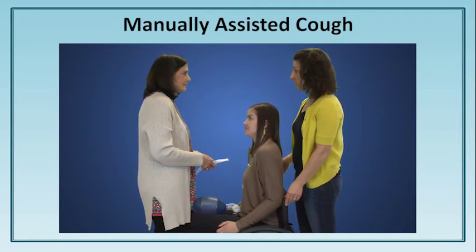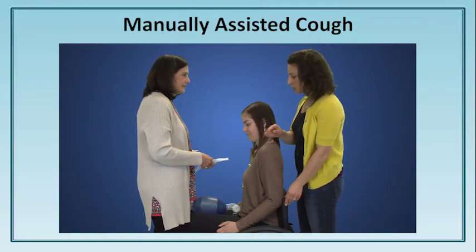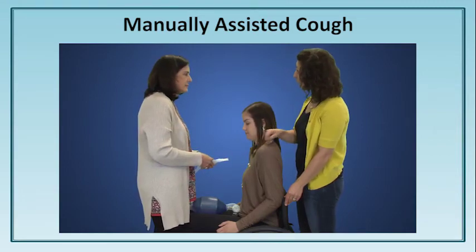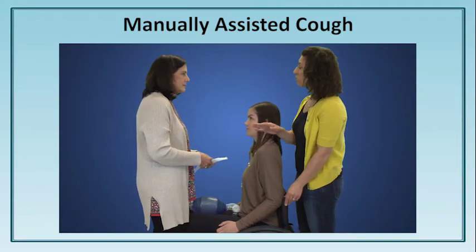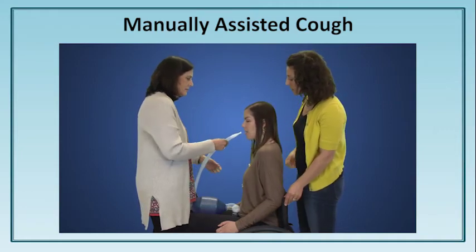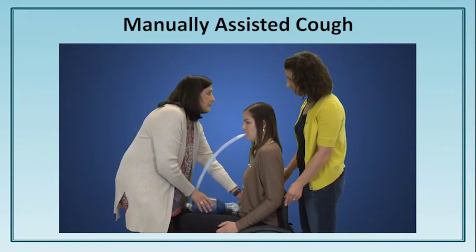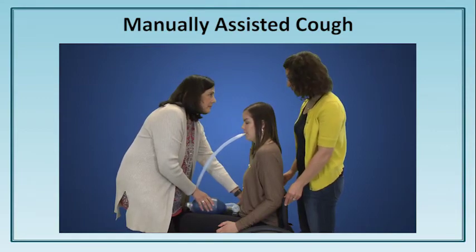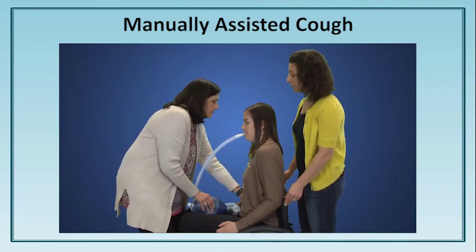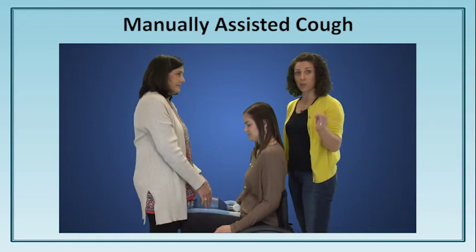You're comfortable with manual assisted coughing. You're already in great position — your feet are on either side of Emma's feet on the footrest. We have the manual hyperinflator on Emma's lap so you can compress the bag with one hand. To get into position, place the mouthpiece into Emma's mouth, one hand on Emma's stomach ready to provide a manual assisted cough. Emma takes four compressions for full chest rise. I'll count with you — one, two, three, four, hand on her stomach, and cough. Good job.